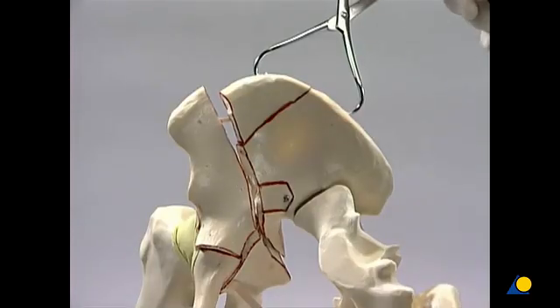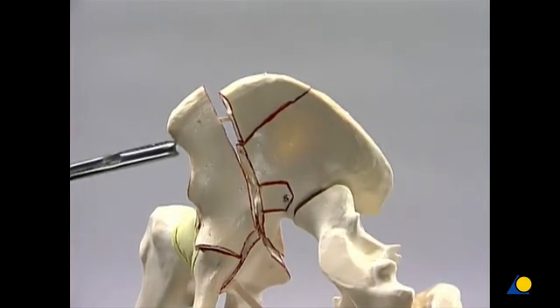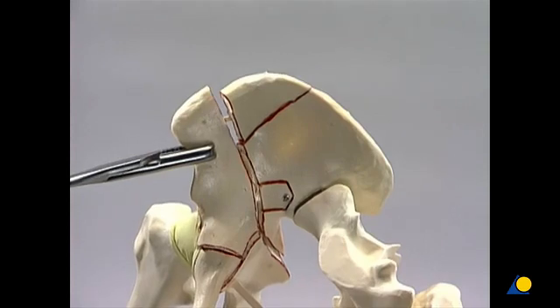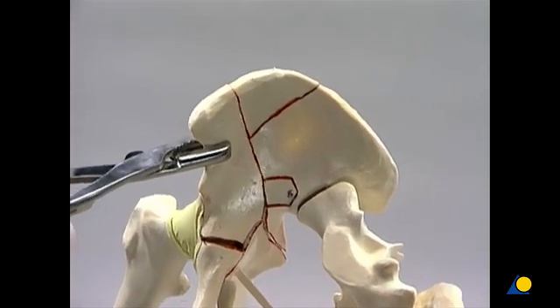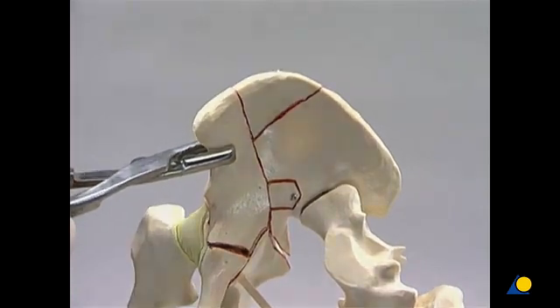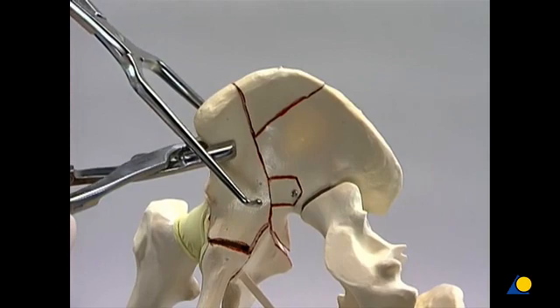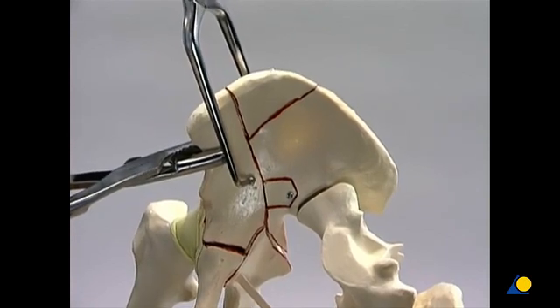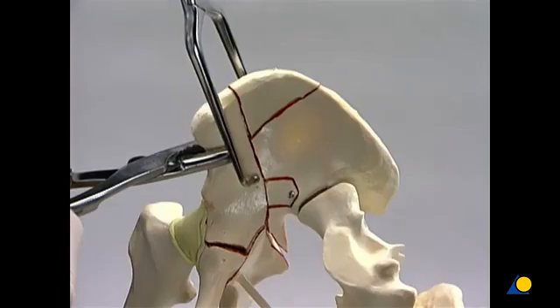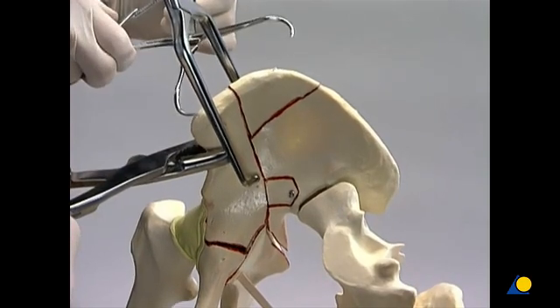The pointed reduction forceps is removed. Now the concavity of the iliac fossa must be restored. The iliac wing is rotated internally using a Faraboeuf clamp. The large pelvic reduction forceps is positioned around the anterior column and the repaired portion of the iliac wing to provide additional reduction across the oblique fracture line. Care is taken not to inadvertently open the fracture on the opposite side.